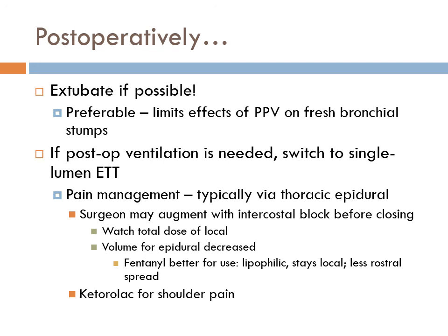Take the tube, whatever's appropriate for the patient to wake up on, and stick your tube on. Same with the bougie. Stick it up, stick it up, stick it up. And once it gets down to the cords, you're going to feel a little bit of resistance. Don't jam it in. Twist the tube. It usually pops up and over the cartilaginous, what is it called? The arytenoids and the corniculate. Now your tube's in, take it out. Still listen like you normally would to make sure that you're definitely in.